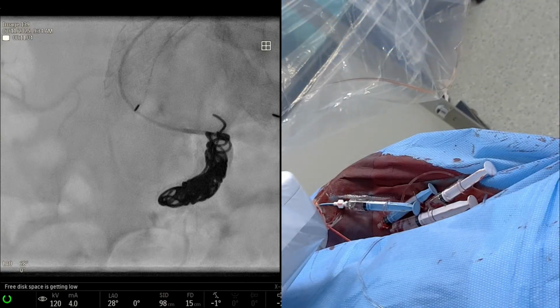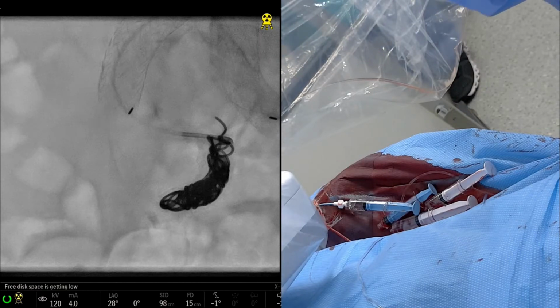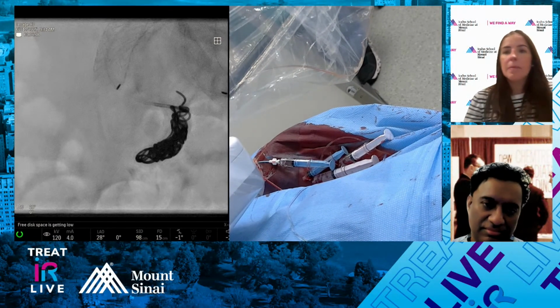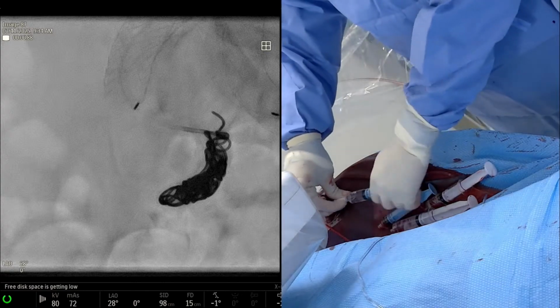Yeah. Sometimes the packing coils will go into that ostium, into the branch. Sometimes the soft coils will just get into the branch. So I think we were having issues when you had to pull it out first, and then pull it from the loop. They call it liquid metal.